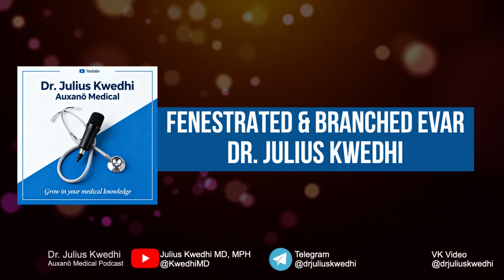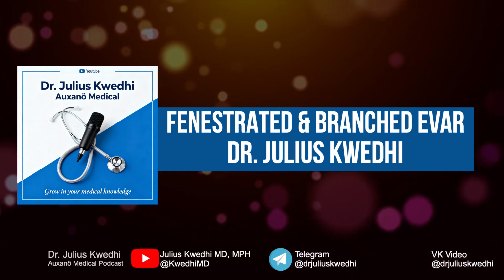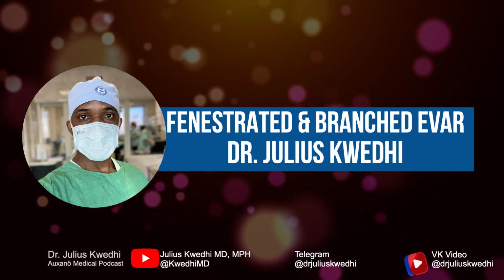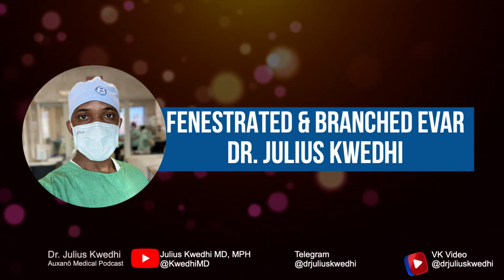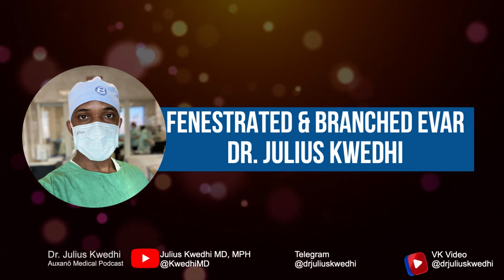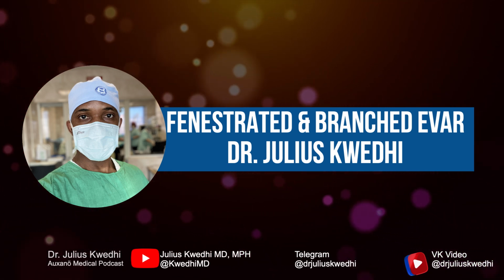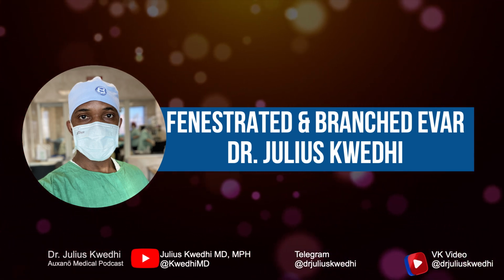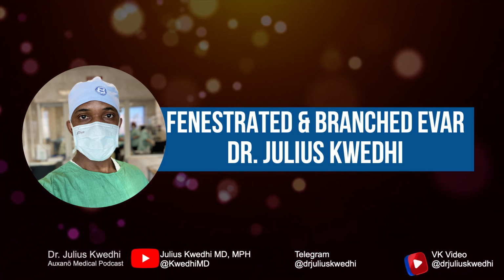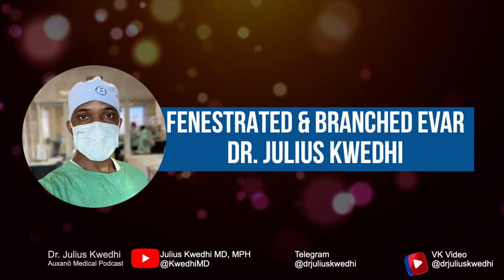Today's episode tackles what many consider the frontier of endovascular surgery, fenestrated and branched EVAR for complex aortic aneurysms. So, Professor King, for our listeners who primarily work with standard infrarenal EVAR, can you frame the clinical problem that these techniques solve? Absolutely. The challenge we face is that approximately 15 to 20% of abdominal aortic aneurysms extend to or above the renal arteries, what we classify as juxtarenal, pararenal, or thoracoabdominal aneurysms.